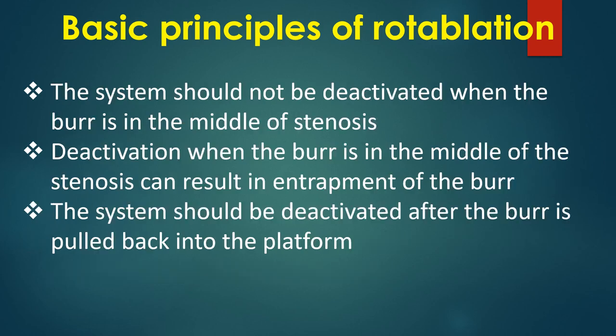The system should not be deactivated when the burr is in the middle of the stenosis. Deactivation when the burr is in the middle of the stenosis can result in entrapment of the burr. The system should be deactivated after the burr is pulled back into the platform.